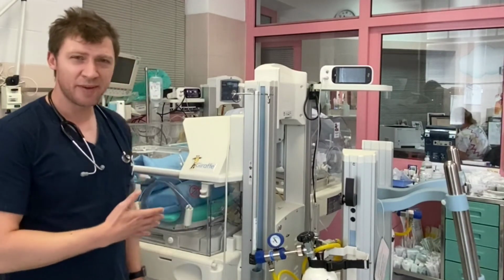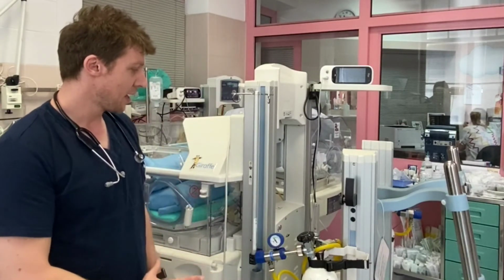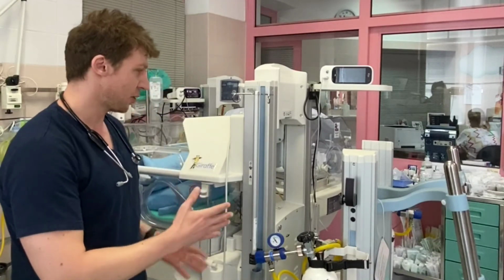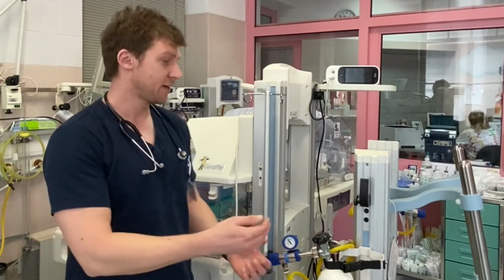It's composed of Omnibed and the GE shuttle system, which you see here. And it's not just a battery, the source of power, but also a source of oxygen and air. This complete system enables us to buy time, which is precious for everybody, but especially for the tiniest infants. What we had to do before was intubate most of them, because there's a distance between the delivery room and the ICU. But nowadays, non-invasive ventilation is preferred. So this system enables us to go, completely mobile, to the delivery room, admit the patient to the Omnibed and do whatever is necessary, the initial resuscitation, and carry the baby back within the incubator using non-invasive ventilation.